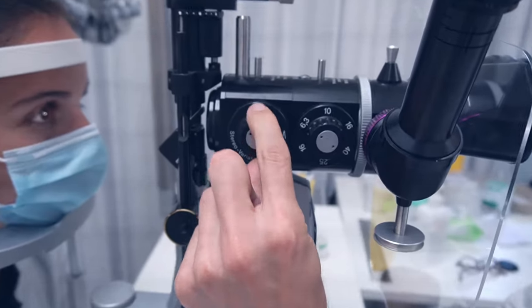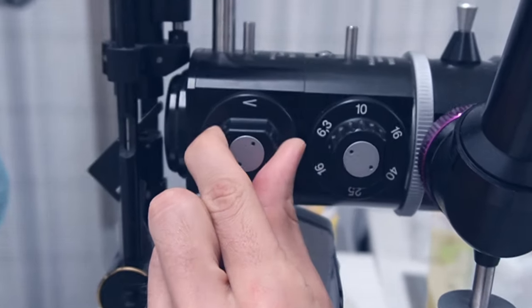Hello and welcome back to learnabouteyes.com. In this episode we're going to look at one super cool part of the slit lamp, the stereo variator.